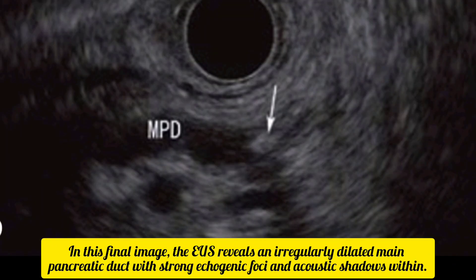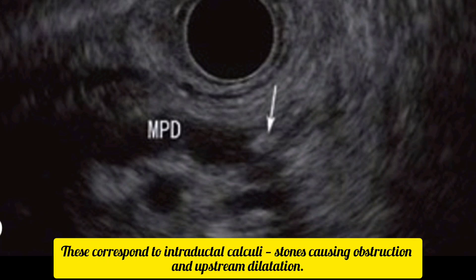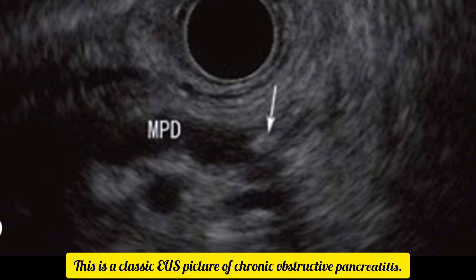In this final image, the EUS reveals an irregularly dilated main pancreatic duct with strong echogenic foci and acoustic shadows within. These correspond to intraductal calculi — stones causing obstruction and upstream dilatation. This is a classic EUS picture of chronic obstructive pancreatitis.